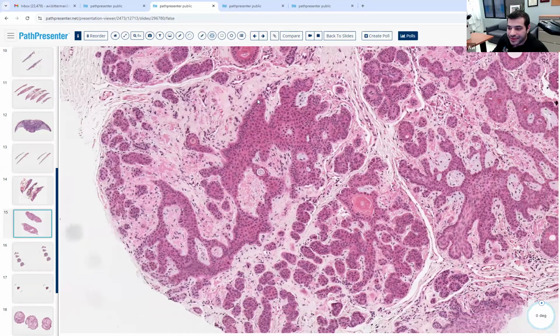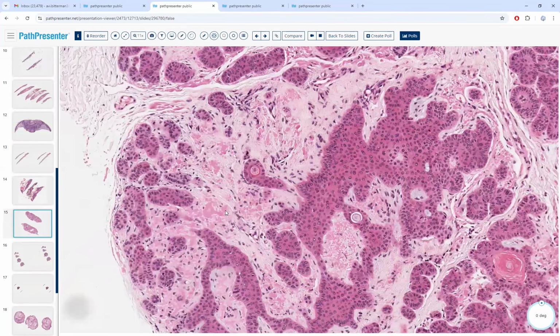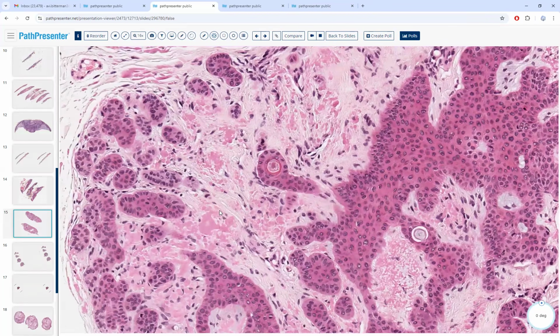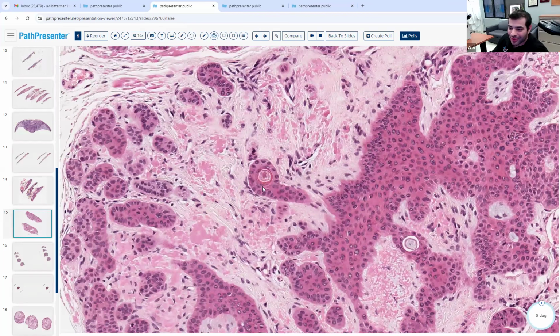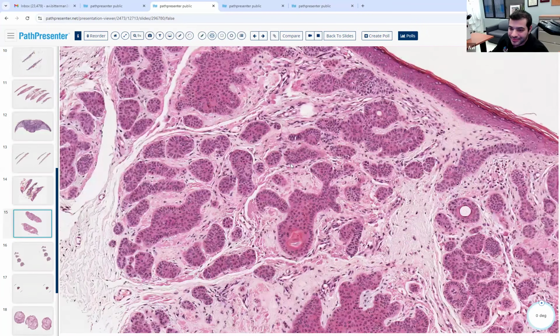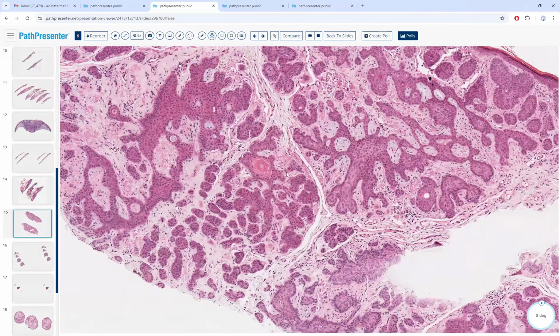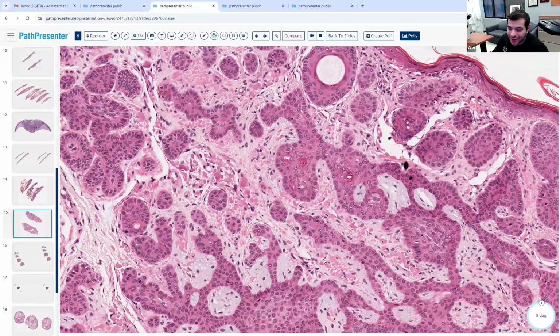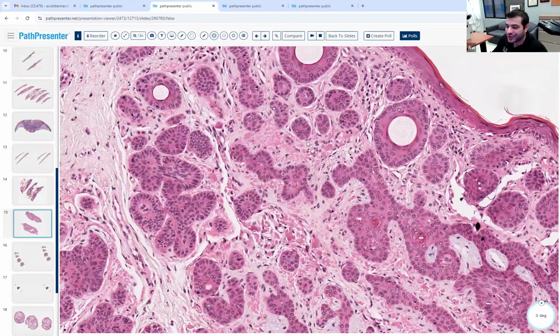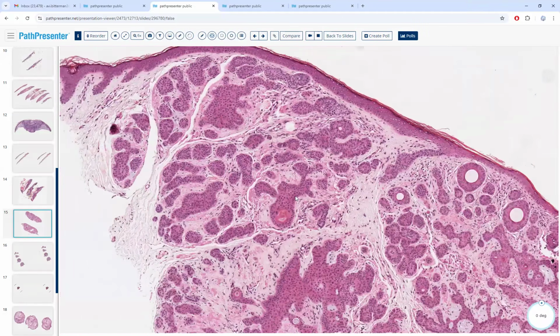Describe the stroma for me. It's fibrotic, kind of amorphous. Yeah, it has this kind of amyloid look to it. Amyloidy, fibrotic, amyloid-like. Those are our amorphous pink stuff in the dermis differential. Yeah, this amyloid-like stroma is actually a helpful clue to this entity. Infundibulocystic BCC.